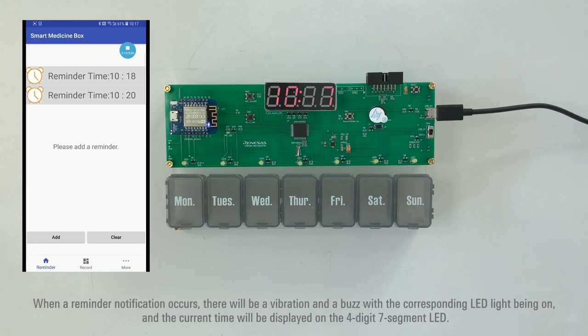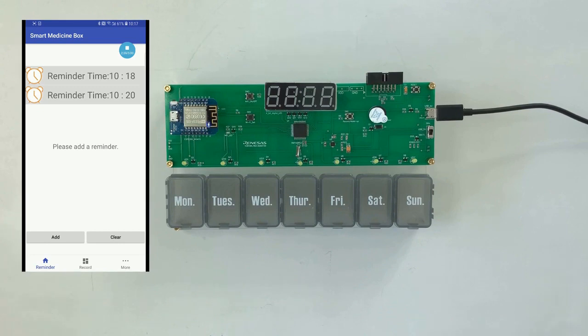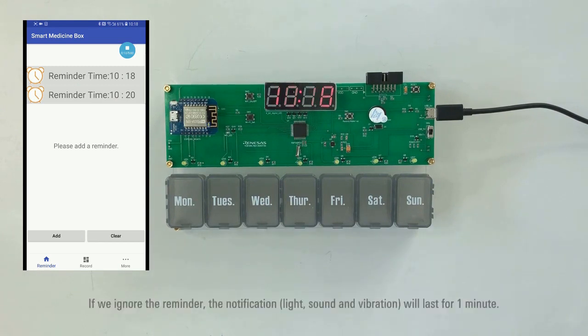When the reminder notification occurs, there will be a vibration with the corresponding LED light being on, and the current time will be displayed on the 4-digit 7-segment LED. The notification event will be uploaded to the cloud if SW1 is pressed. If we ignore the reminder, the notification will last for one minute.